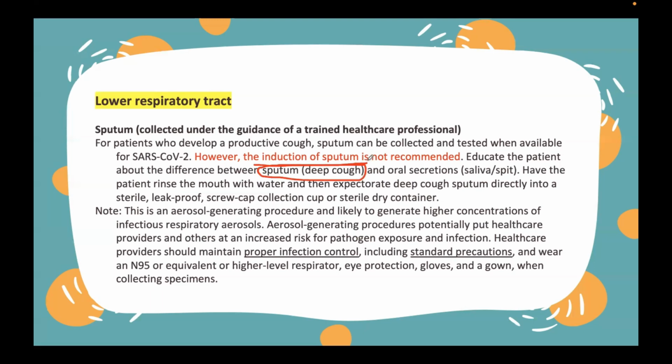Baka mamaya ang maibigay sa'yo na sample ay galing sa oral secretions or saliva lang. Okay? Galing lang po sa mouth yon. Hindi siya galing sa lungs. So, if ever may present man na pathogens dyan, hindi ma-detect yung targeted mong pathogens kasi hindi galing sa lungs. Galing lang siya sa iyong saliva.